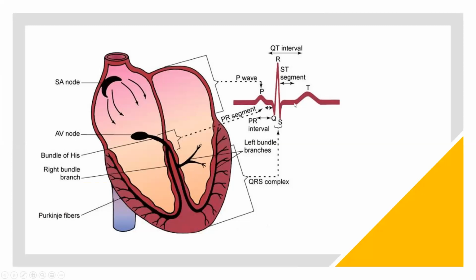Then I've also put the picture over here so you can see as it relates to what you're going to see on your EKG. And we will go into more detail on this, but the P wave is that atrial contraction right here. Okay. There's a PR segment, which is that time from the atria contracting until the AV node begins to fire. Then we have what we call the QRS complex, and the QRS complex actually is when the ventricles are doing their thing. They're in their jam doing what they need to do. Then we move to the ST segment, and that's where those cells are kind of resetting, trying to start all over again, moving into the T, which is right before we move into another heartbeat.